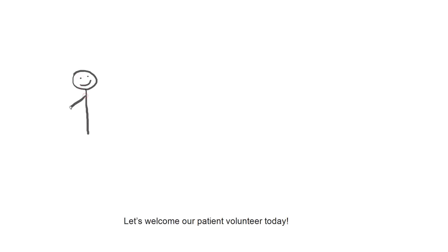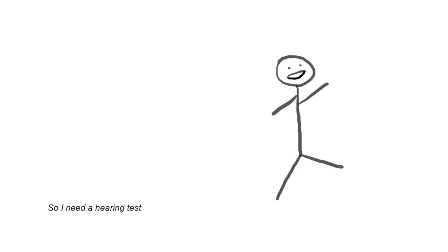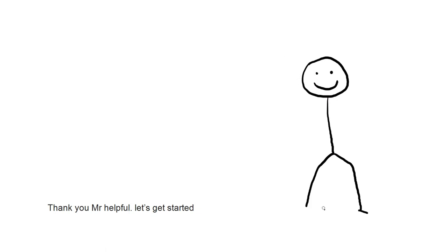Let's welcome our patient volunteer today. Hi, my name is Helpful. I have a very inquisitive personality and I have trouble hearing. So I need a hearing test. Thank you, Mr. Helpful. Let's get started.